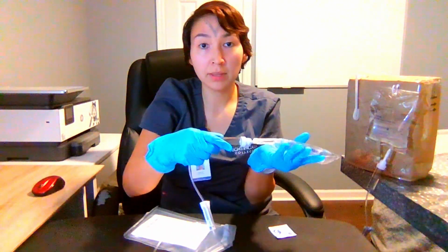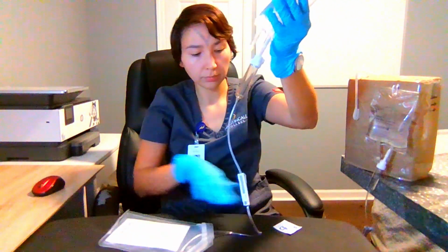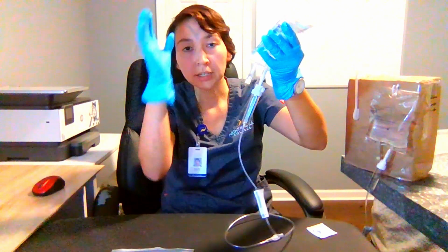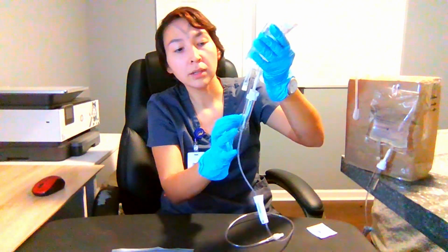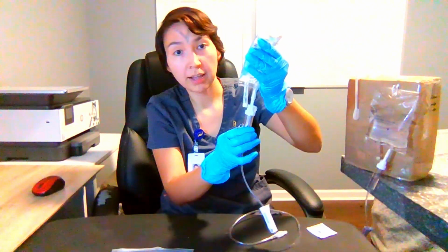Now I'll prime the tubing. Gently compressing the drip chamber to fill halfway.